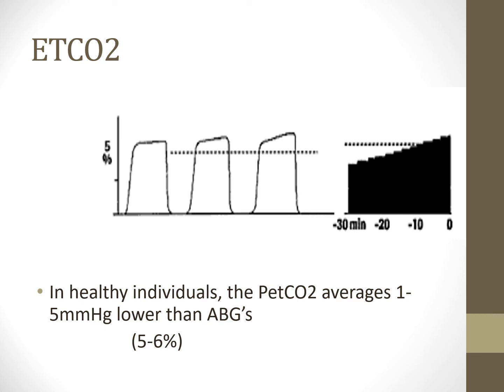Right? So if you've got someone with severe air trapping, or a lot of dead space issue, their end-tidal CO2 may actually be quite a bit lower than their PaCO2. Let's say we've got a patient on a ventilator and there's too much pressure and we're over-distending the alveoli, the respiratory zone. Well, it's causing the capillaries on the outside of the alveoli to be squished, which means there's less blood flow, which means the end-tidal CO2 is going to look low.